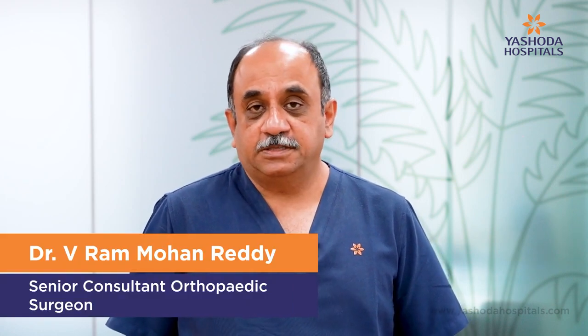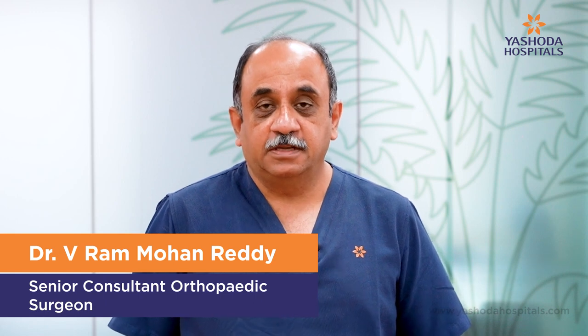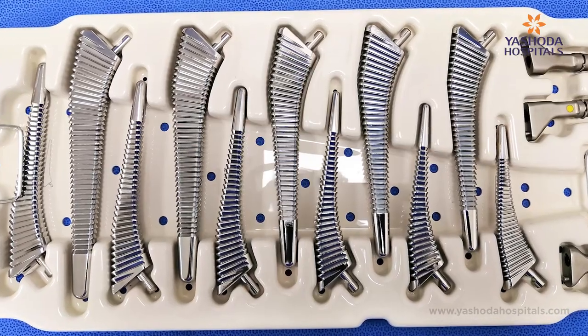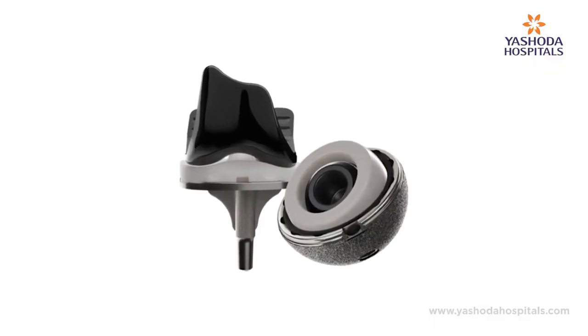Of all the three robotic systems, the first robotic system where the surgeon uses the landmarks given by the robotic equipment is probably the most useful one. Along with this system, the implants which are manufactured by the company are very good. For example, the material. Almost all companies have got chromium cobalt steel implants, whereas one particular company where the robotic system is controlled by the surgeon manufactures ceramic or what we call oxynium implants. Oxynium material has got a good outcome for over 25 to 30 years.